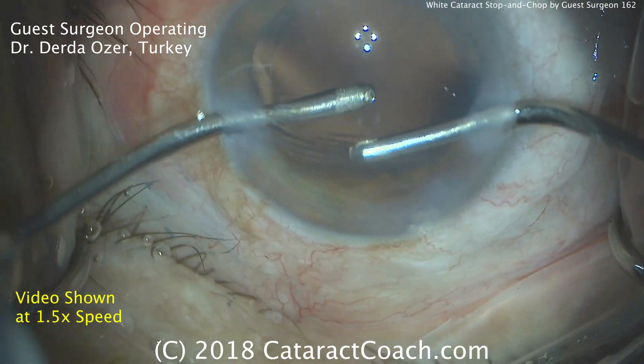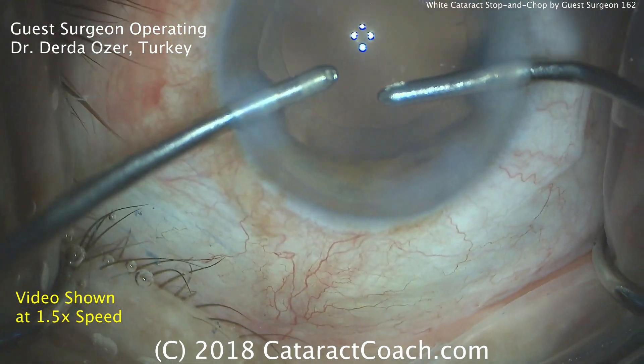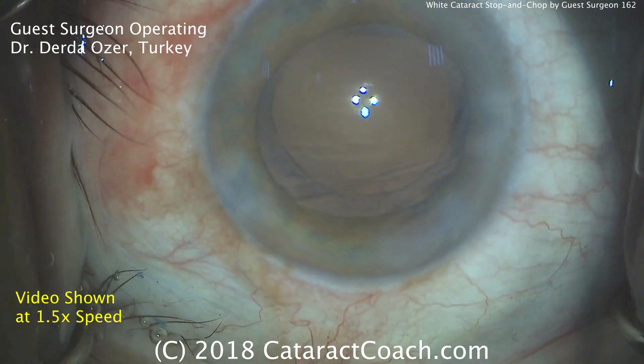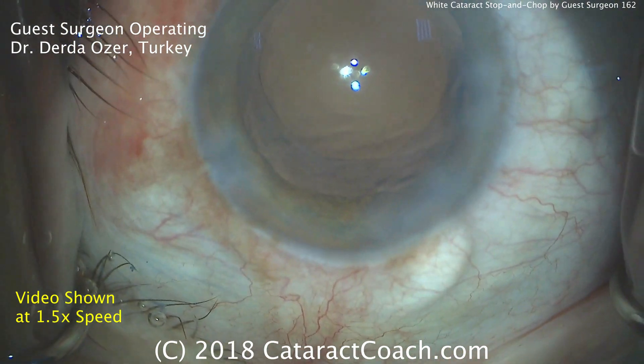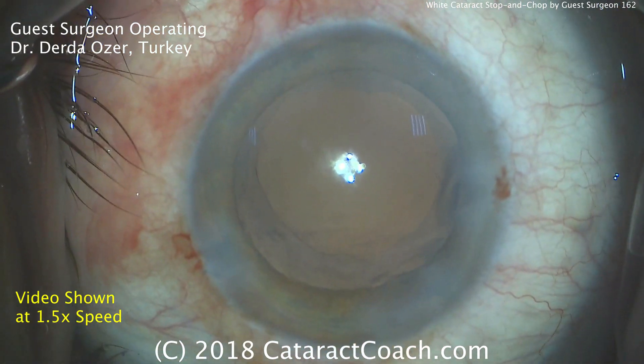This is looking great — this patient is going to be absolutely amazed. This is one of the magical things that we do in ophthalmology. Patients come in with this white cataract, completely opaque; the preoperative vision is probably hand motion. And the patient can end up with great vision the very same day. This is truly amazing.